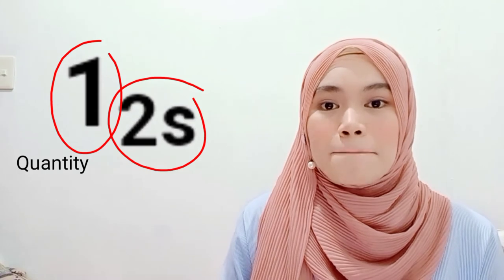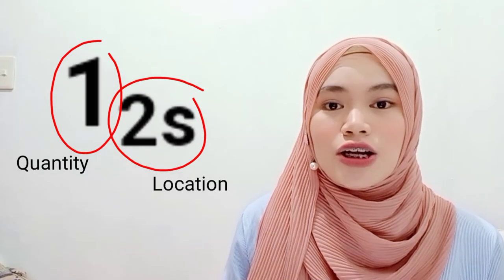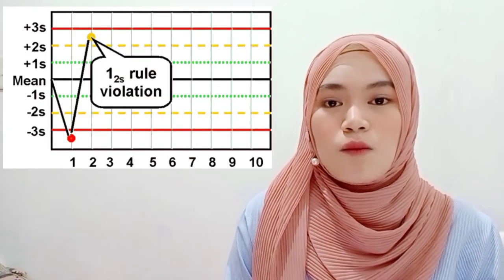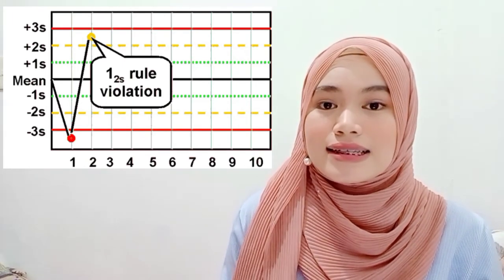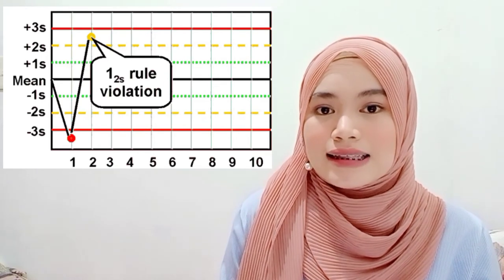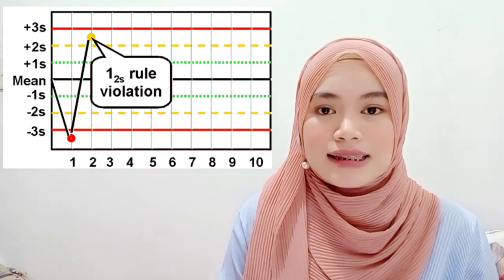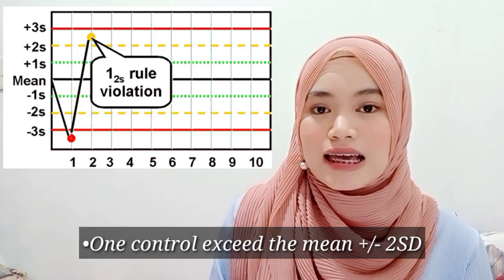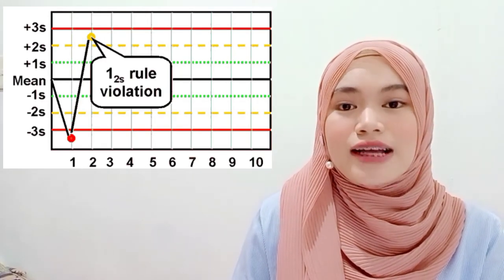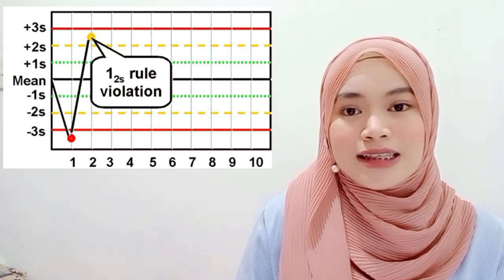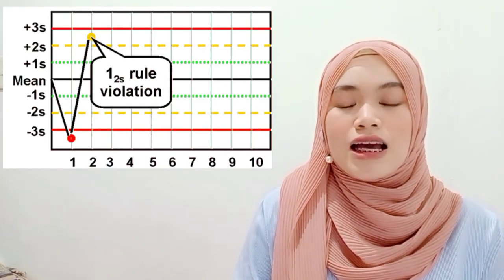Here's a tip: when you see Westguard control rules, the first digit stands for the quantity of the control, and the lower digit stands for the location of the control — where it exceeds. For the first rule, the 1-2s: the number one stands for the quantity of the control, meaning one control, and 2s stands for the location of the control. So 1-2s means that one control exceeds the mean plus or minus 2 SD. The mean is the measure of central tendency, and the SD — standard deviation — is the measure of dispersion of values from the mean. We have the positive SD on the upper part and the negative SD on the lower part.